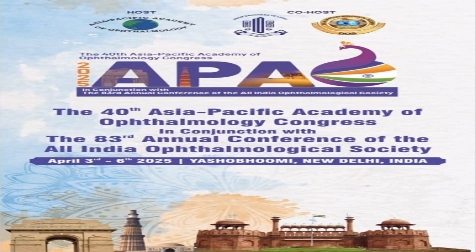Thank you, sir. You have shown us so many nice cases and we do different scenarios. Even in cases of iris tissue defect, you can do a good pupilloplasty and implant the lens. You can even implant the iris lens and then do pupilloplasty, in whichever way you are comfortable. Both ways you can go. It's up to you. One thing is important here.